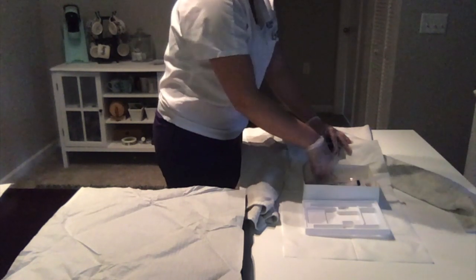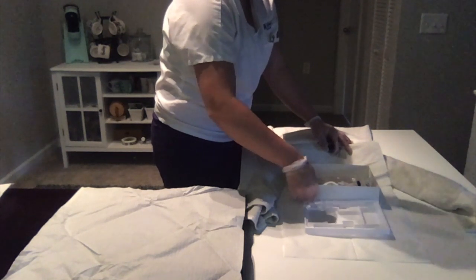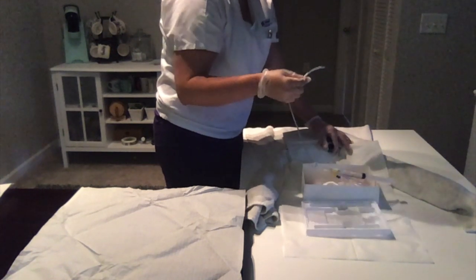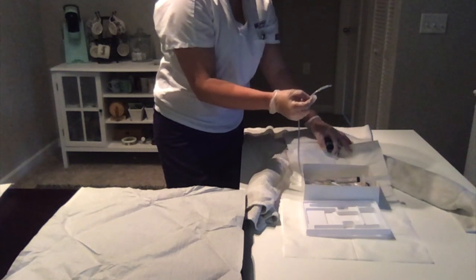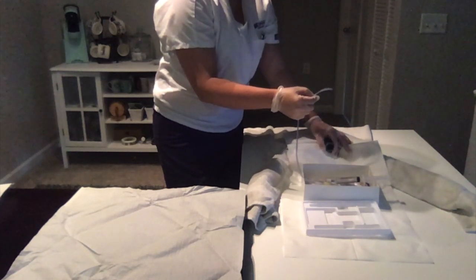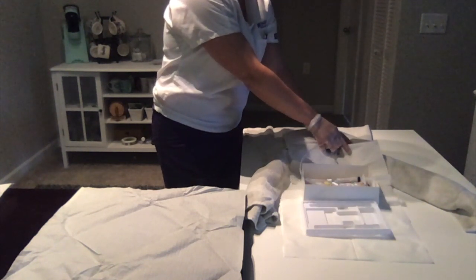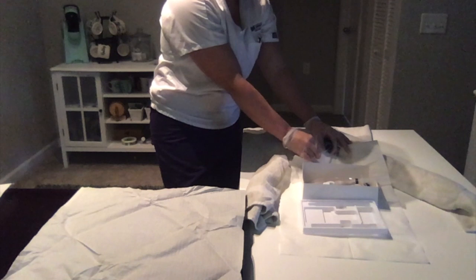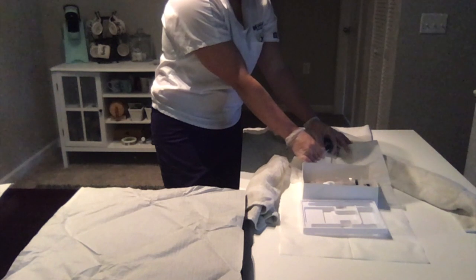Once I have done that, I'm going to take my urinary catheter. I'm going to put 4 inches into the lubrication, and then with this hand, I can go ahead and insert my catheter. So this hand, or my left hand, cannot touch the catheter at all, and this hand needs to maintain that sterility. So I'm going to go ahead and insert my indwelling catheter. I'm making sure that I'm not touching it at all. So my hand, I don't know if you can see it, is not touching the skin at all.